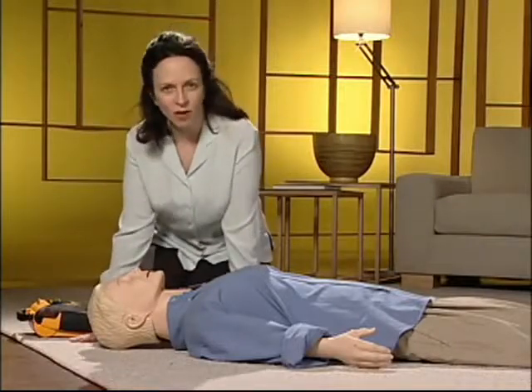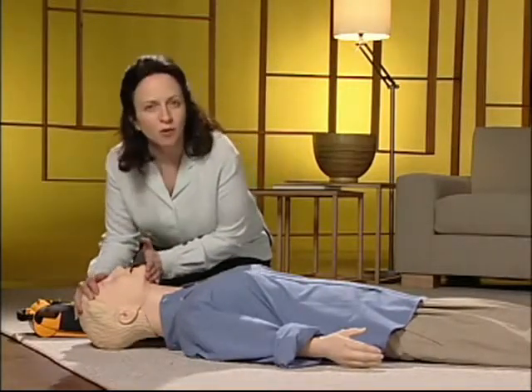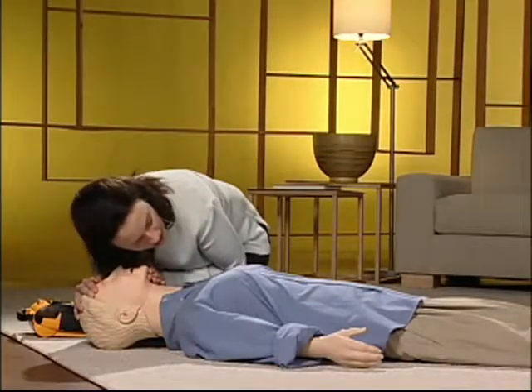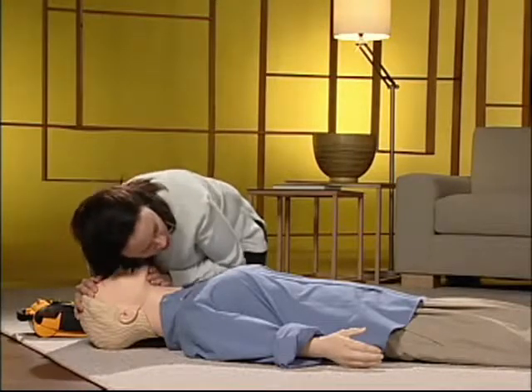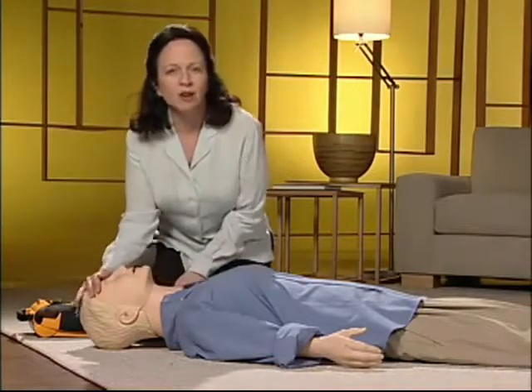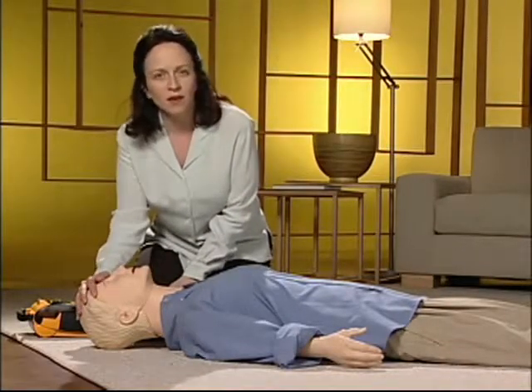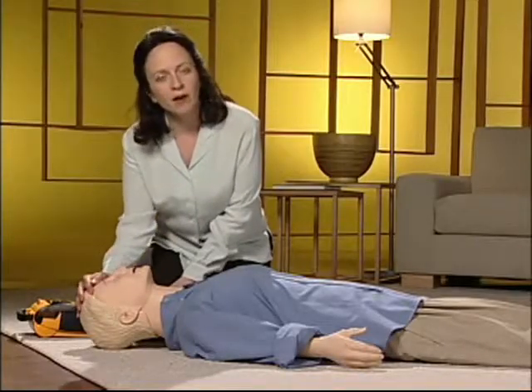Next, open the airway. Tilt their head back and lift their chin like this, and check for normal breathing. Place your ear over their nose and mouth and listen for breathing. Look at their chest to see if it rises. A person in cardiac arrest either does not breathe at all or has abnormal breathing. And again, abnormal breathing might be gasping or snoring breaths.